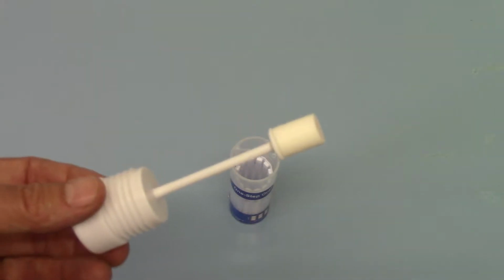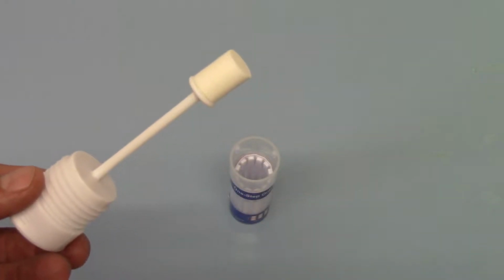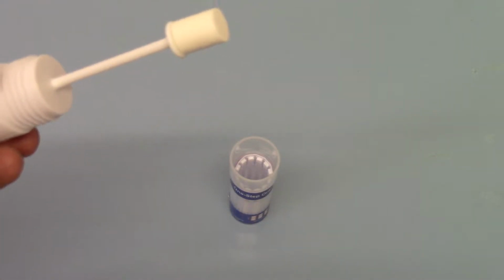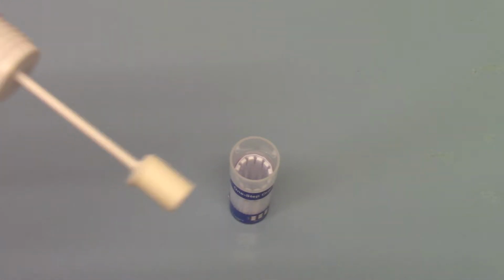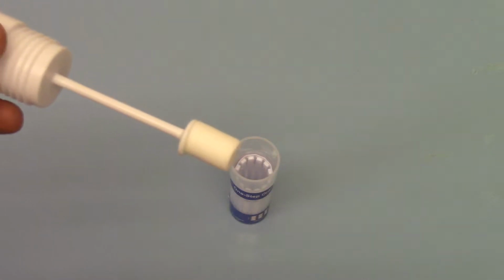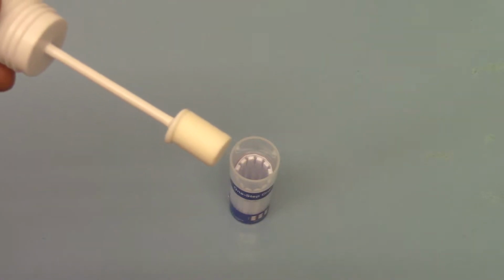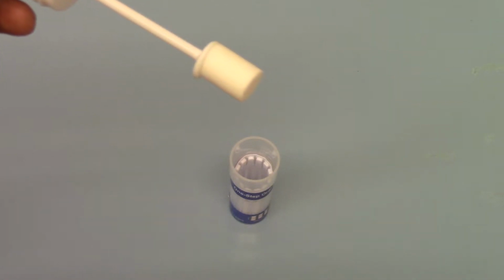The initial procedure for collecting samples would be to move this around the top buccal membrane and bottom buccal membrane in front of the teeth down each side of the cheeks. This can be done by the person that you're testing. Just ask them to rub it gently on the side of their mouth, each side, top and bottom, and then pass it on towards the top of the tongue and just ask them to hold it in their mouth and feed saliva gently onto that swab until it's completely squashed and is soft when they move it against their tongue.